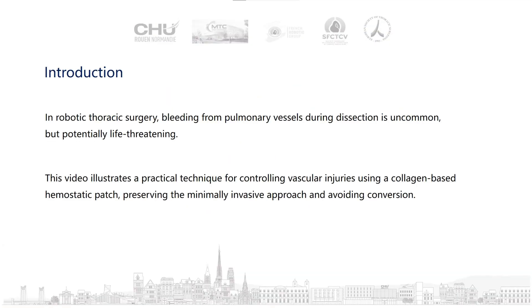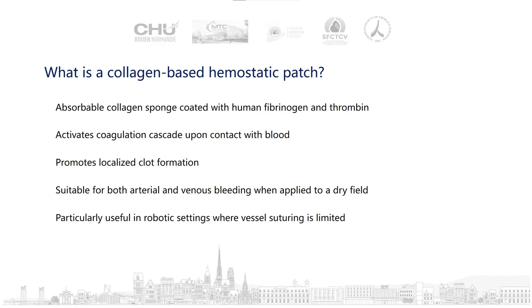In robotic thoracic surgery, bleeding from pulmonary vessels during the section is uncommon but potentially life-threatening. This video illustrates a practical technique for controlling vascular injuries using a collagen-based hemostatic patch, preserving the minimally invasive approach and avoiding conversion. A collagen-based hemostatic patch is an absorbable collagen sponge coated with human fibrinogen and thrombin. It activates the coagulation cascade upon contact with blood and promotes localized clot formation. It is particularly useful in robotic settings where vessel suturing is limited.